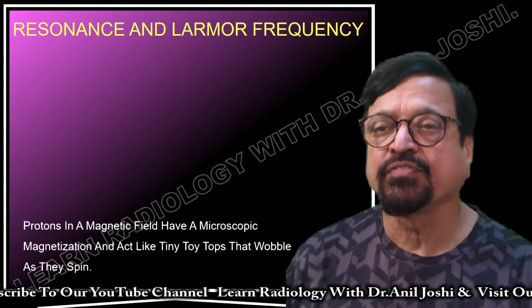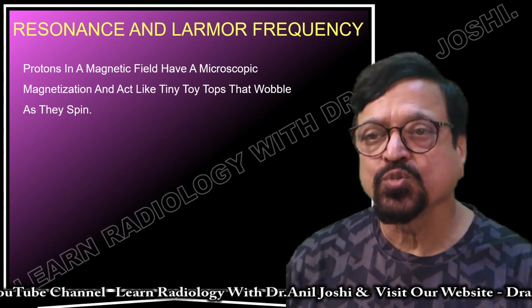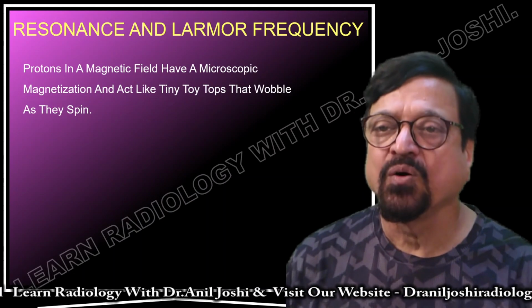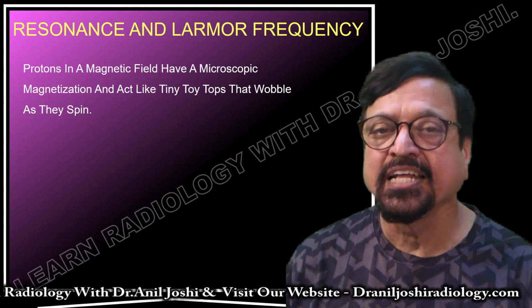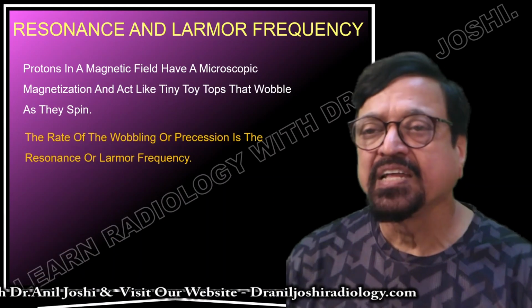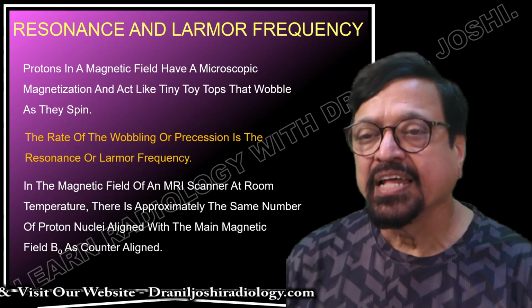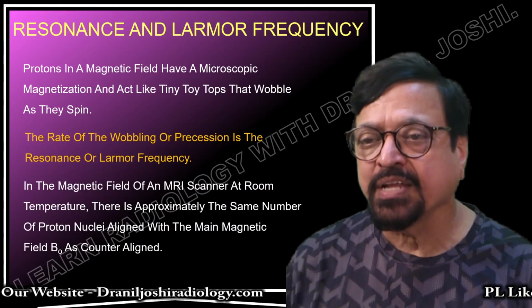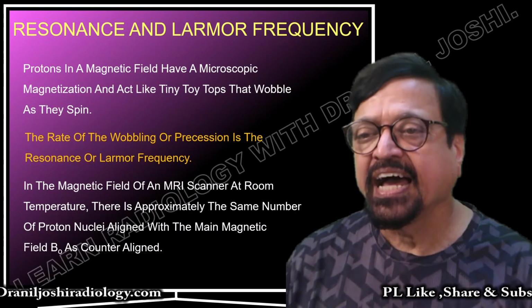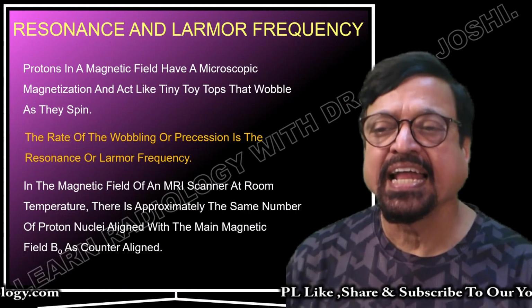Now resonance and Larmor frequencies. Protons in a magnetic field have a microscopic magnetization and act like tiny tops that wobble. That is, we have seen how the spinning top is wobbling. They are like that. That's why we have shown it to you at the beginning of the lecture. The rate of the wobbling of the precession is the resonance or Larmor frequency. Now, in the magnetic field of an MRI scanner at room temperature, there are approximately the same number of protons aligned with the main magnetic field B0 as counter-aligned.